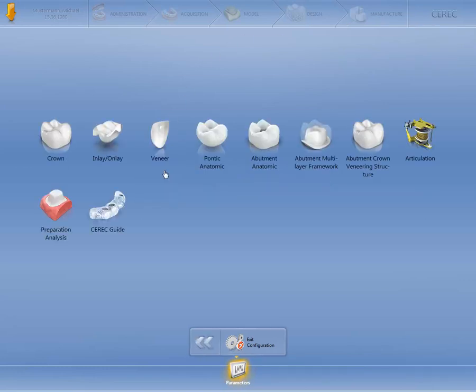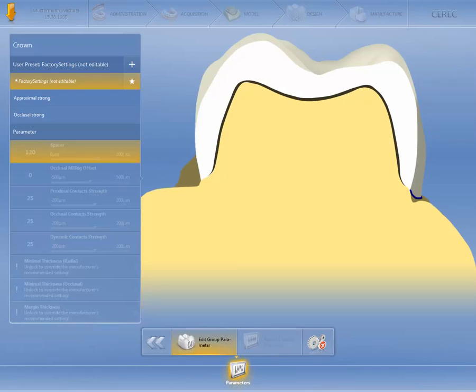The Parameters menu is structured by restoration type and you can define the settings for each restoration type separately. For our example, we will open the settings for a crown. The restoration parameters found here are referred to as Global Parameters.